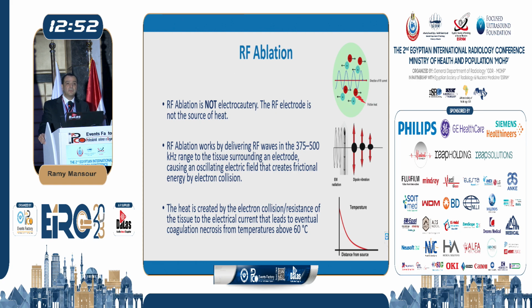It's very, very important to understand that radiofrequency ablation is not electrocautery. The source of the heat is not the electrode itself. The source of the heat is the tissue around the electrode. And it's very, very important. This makes it safer than other techniques.